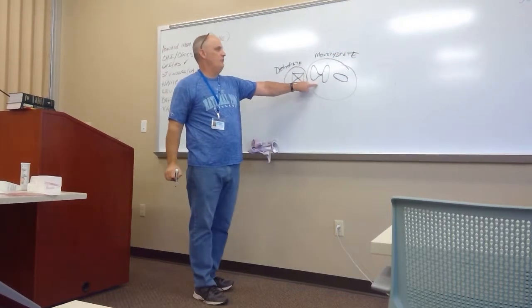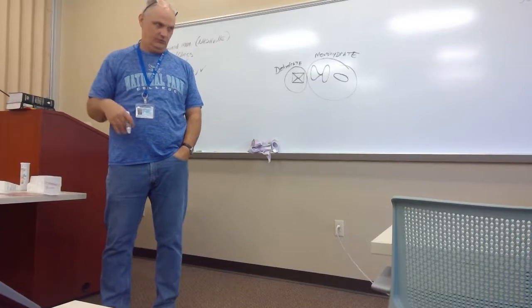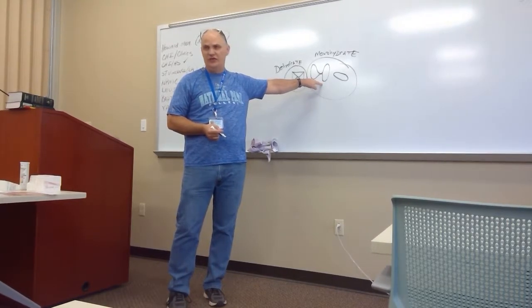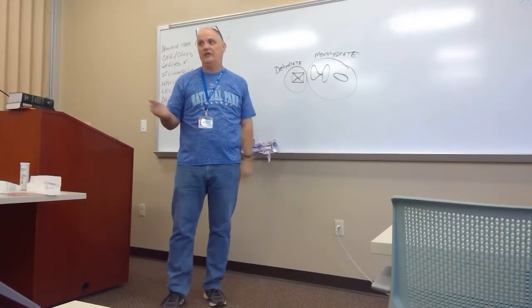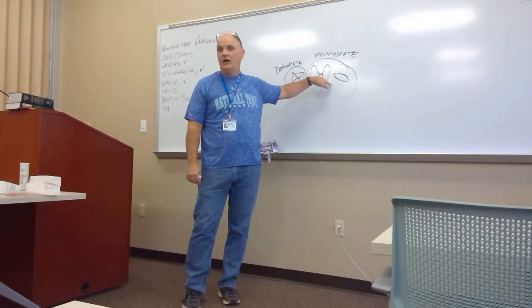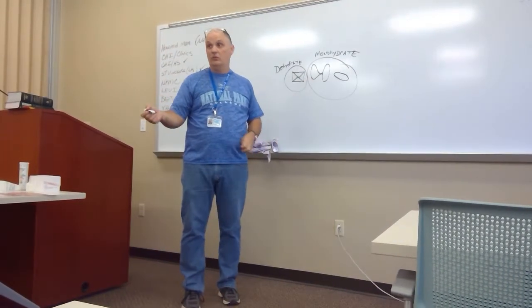The reason this is so important, if you were to be looking at a urine specimen, especially on a younger child, somebody that's maybe 3, 4, 5 or 6, if you see massive amounts of this in a urine specimen sediment, there's a good chance that that child has swallowed ethylene glycol. Oh. Okay, because any child that drinks radiator fluid, because of its sweet taste, these will be everywhere in the urine sediment, the monohydrate form. I've never seen that, but I'm just telling you that if you were to see these type of crystals everywhere, you need to make sure and report that out.